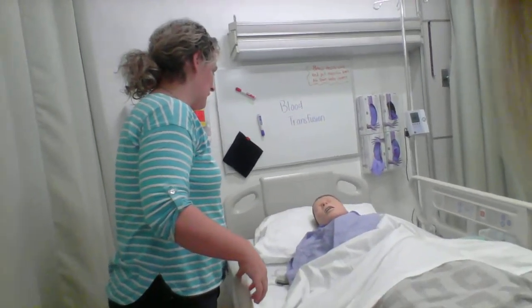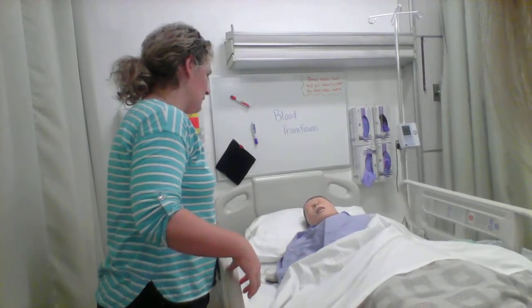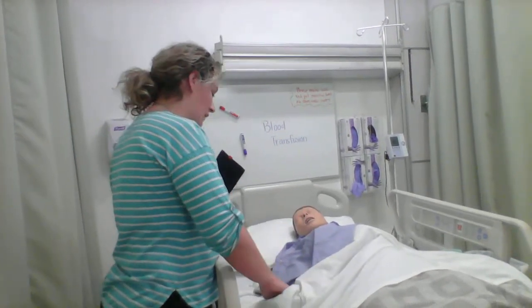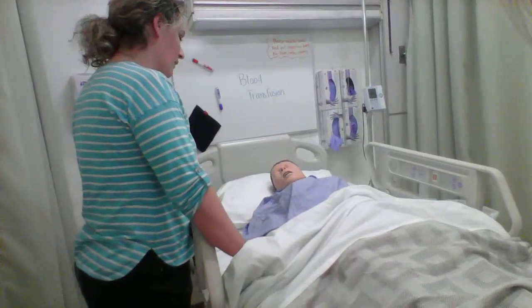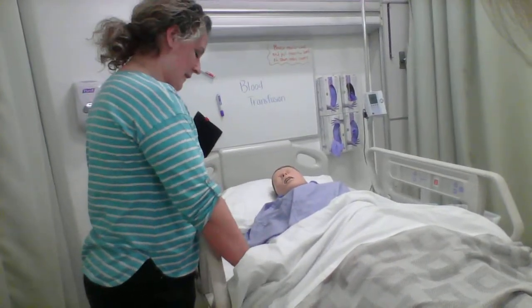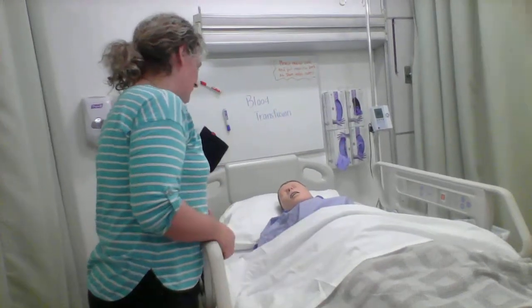I noticed that you signed that in the consent form. I just want to confirm that. Okay, and you're okay with that. Great. Let me check your name and date of birth and confirm. He states his name and date of birth. Good, so we're in the right place at the right time.